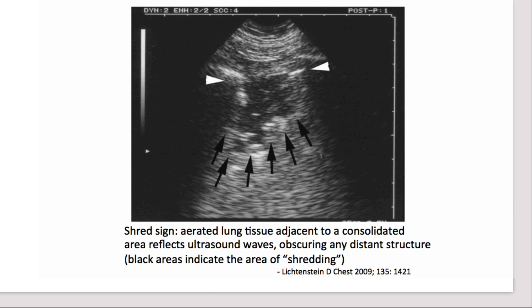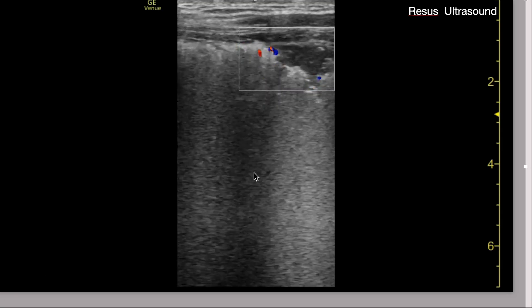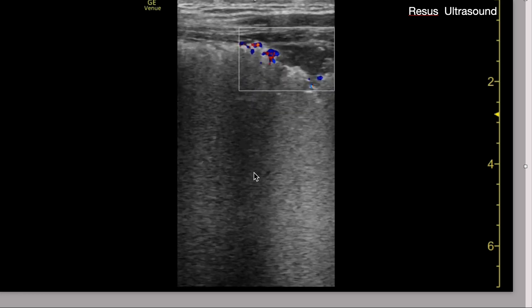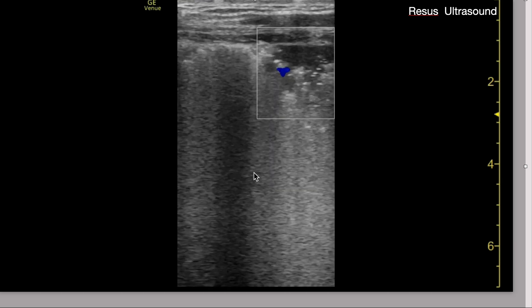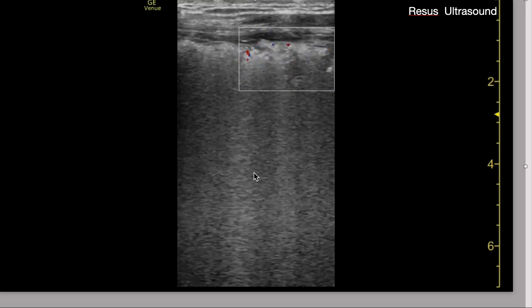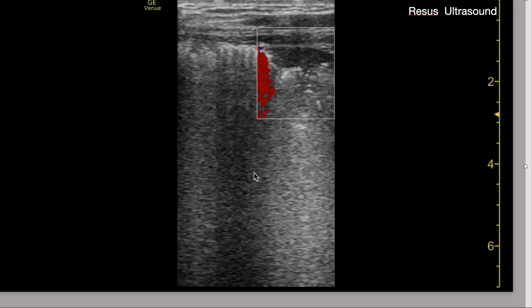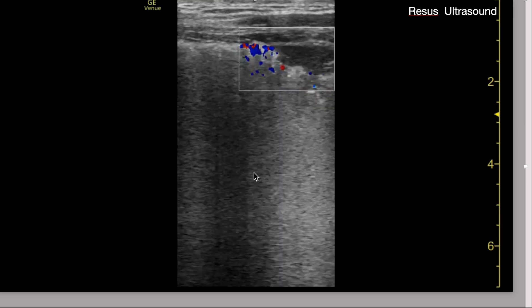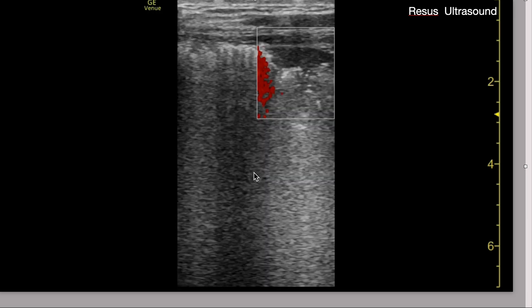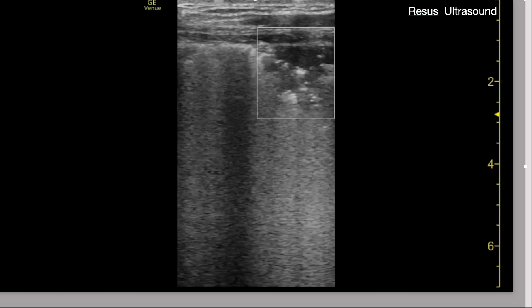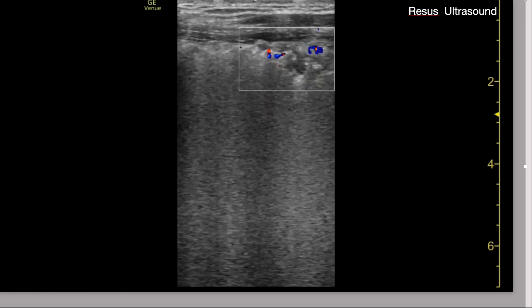Basically, if you see B-lines, try to look further for an irregular pleural line or any consolidation. If you find this and it is not an old lesion, and the patient comes in with dyspnea and has a history of fever or septic shock, this would point more toward pneumonia or any kind of infection. COVID-19 also has this kind of feature as well.